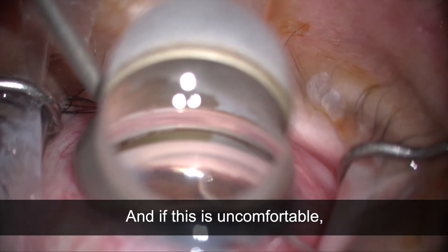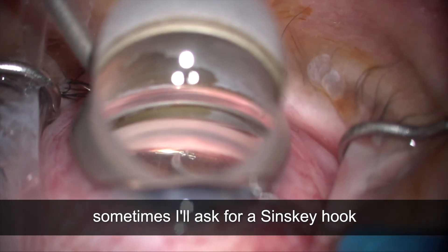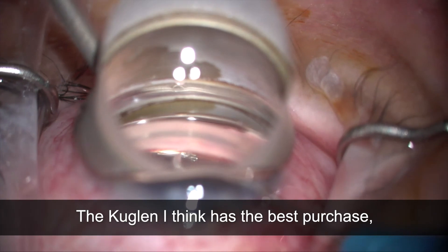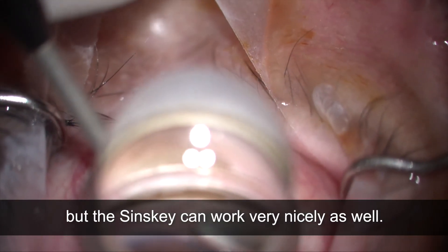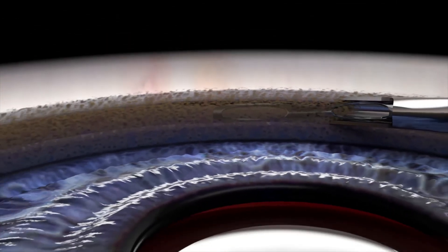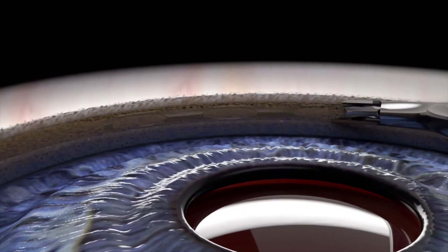If that final adjustment is uncomfortable, sometimes I'll ask for a Sinskey hook or a Kuglin hook. The Kuglin has the best purchase, but the Sinskey can work very nicely as well. Again, this is Nathan Radcliffe demonstrating my technique for Hydrus placement with the Hydrus incision.